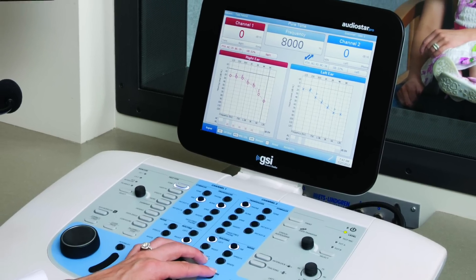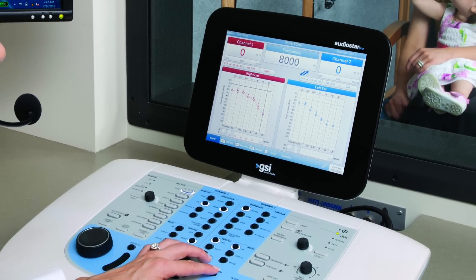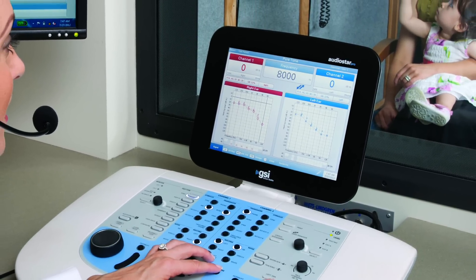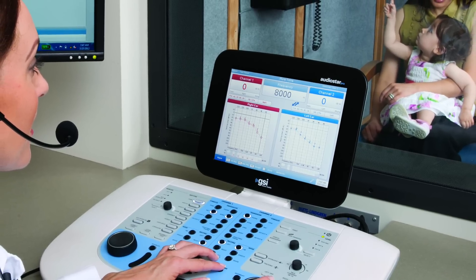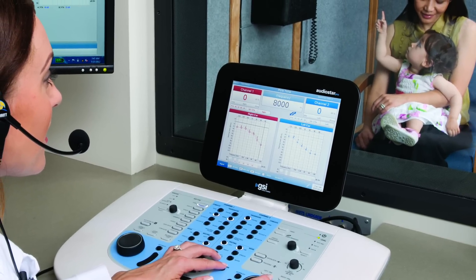AudioLogic testing requires quick thinking and an instrument that can accommodate fast-paced changes. The configuration application allows for a behind-the-scenes setup of default test preferences.